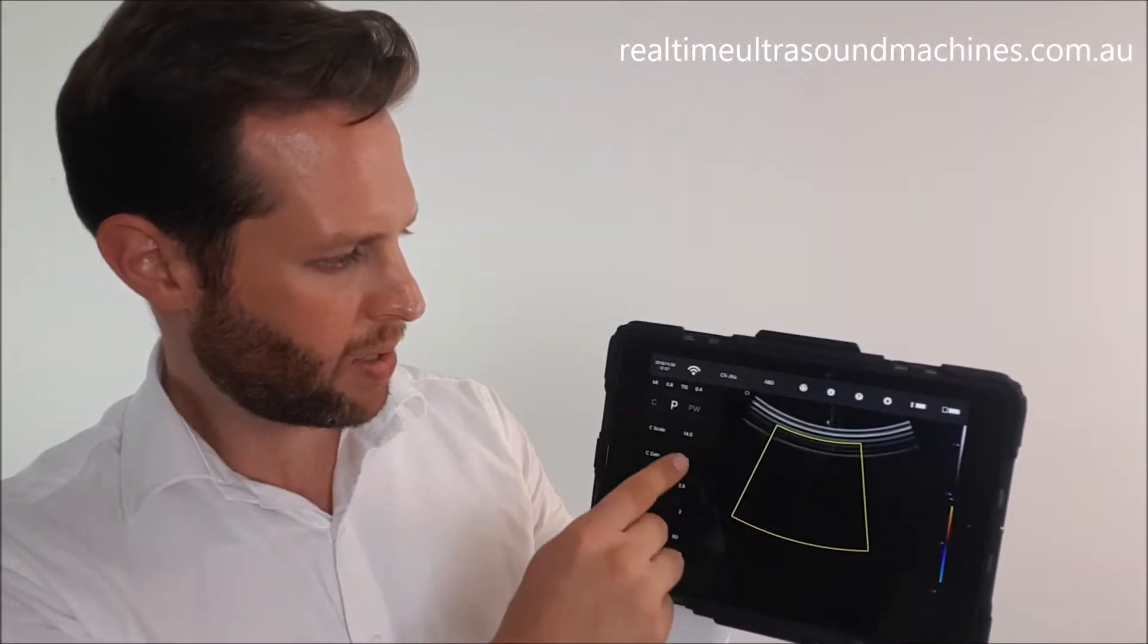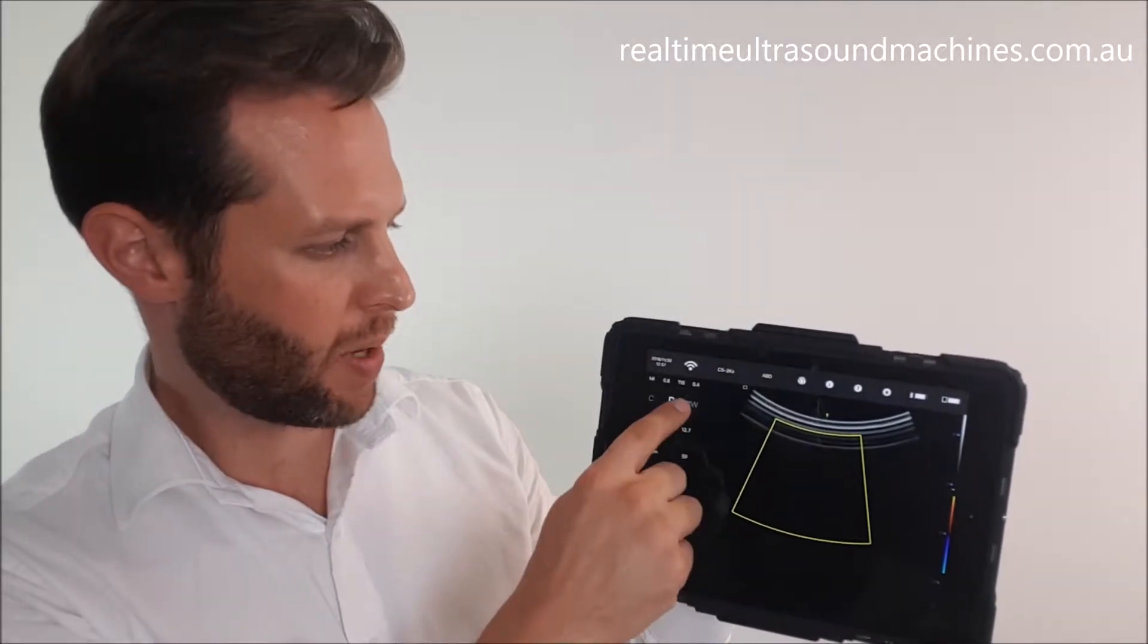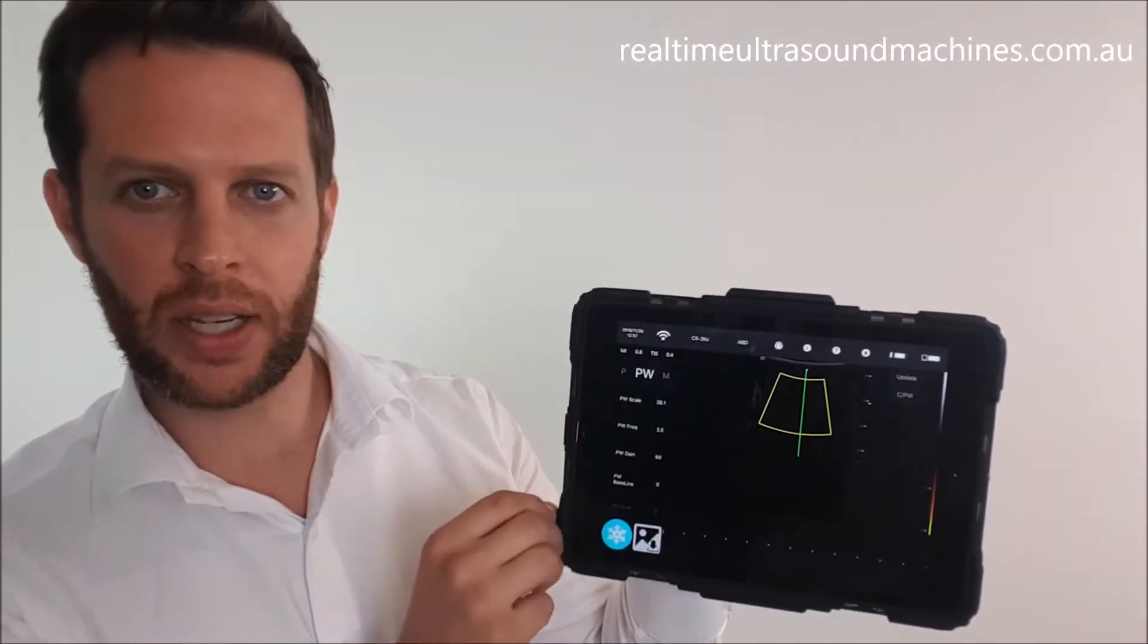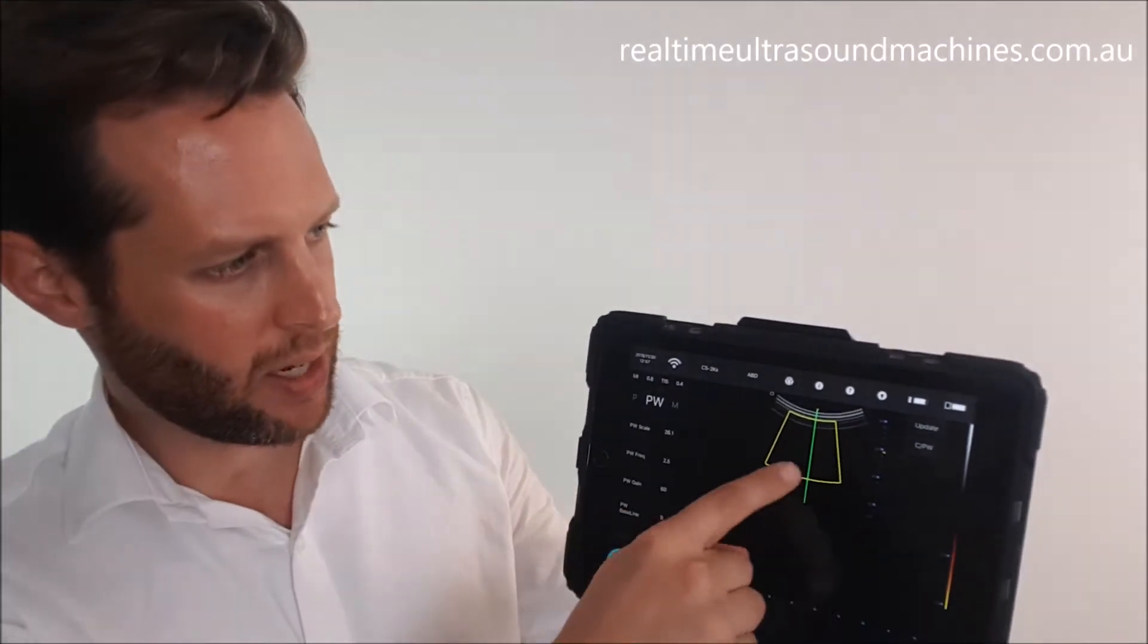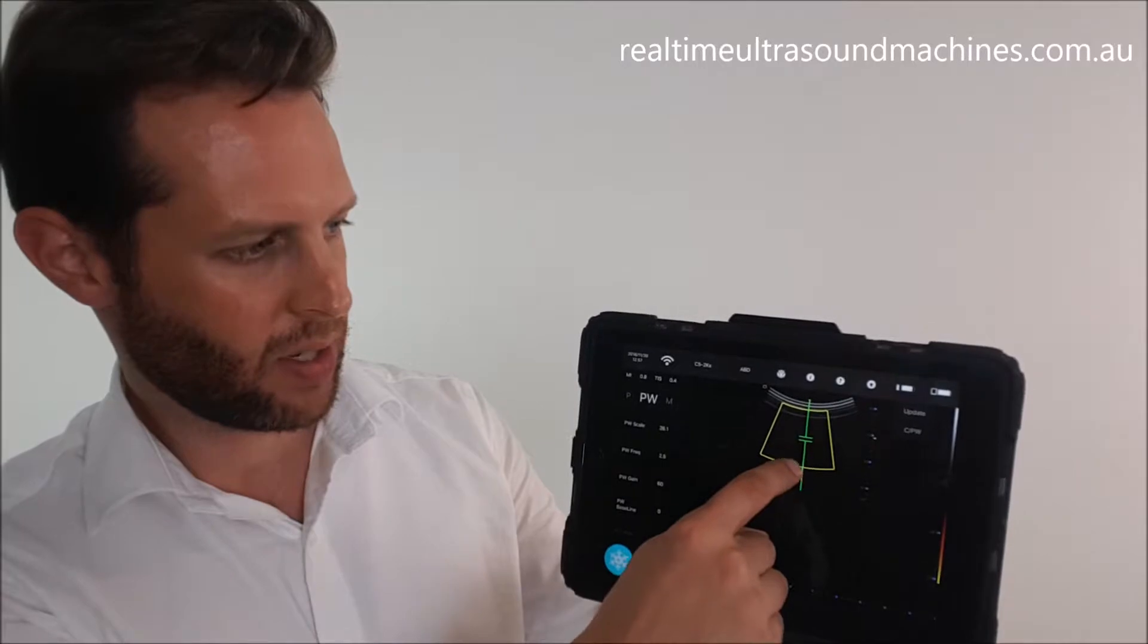For Pulse Wave Doppler, if you slide across, you'll get a little green sampling line here, and you can adjust that using your finger again.